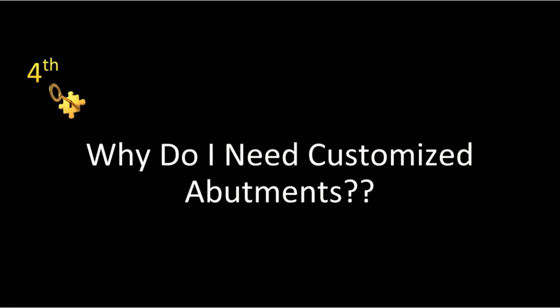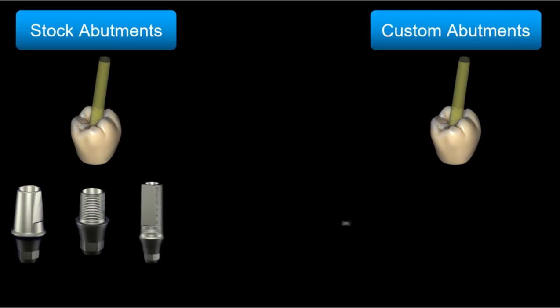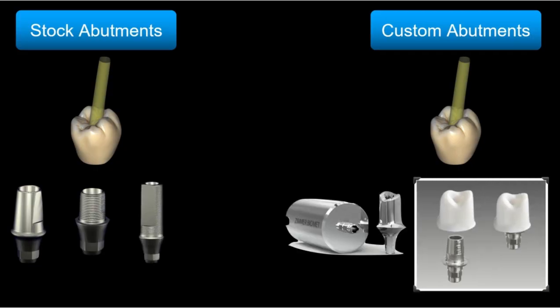The fourth key will deal with the step after scanning and the type of substructure accessory you will select. But still there is another question. What type of abutment will you select? Are you going to put your superstructure, I mean here the crown, directly over the abutment, or are you going to make a custom abutment first and then glue your superstructure over it? On the left side, we can see different stock abutment types like solid abutment, Ti base, Ti cylinder, and on the right side, a pre-mill and zirconia glued on Ti base for customization of the abutment.